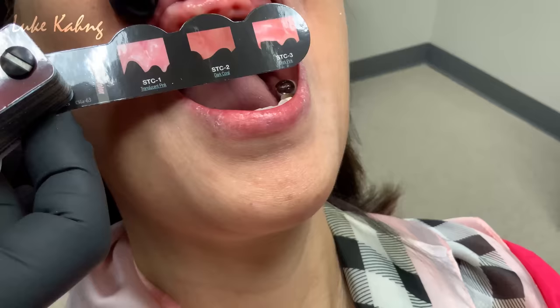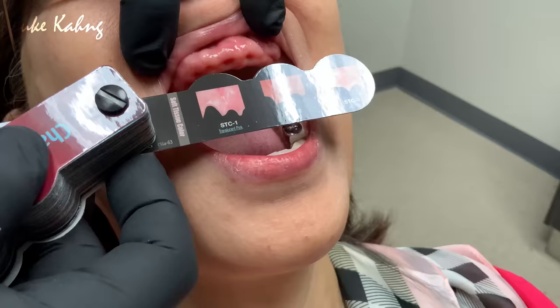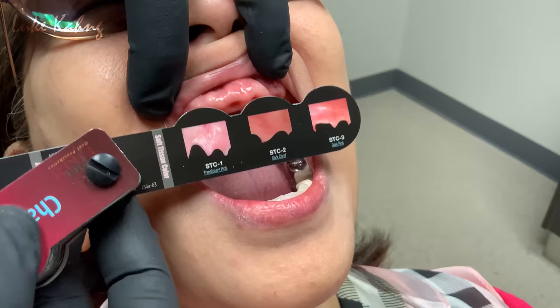That's good. In between. ST3. Yeah, that's pretty nice. That's a pretty nice category. The pictures, then he can zoom in with the pictures and he can make sure that the gum tissue is perfect. Perfect. Okay. This is how I set it up.